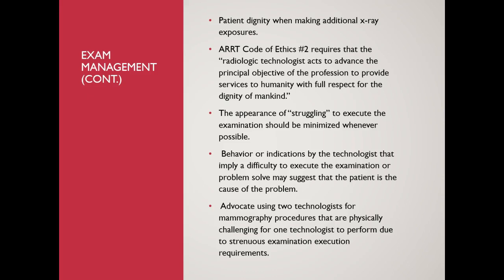The appearance of us struggling or fighting to execute the examination should be minimized whenever possible. Our behavior or indications by the technologist that imply a difficulty to execute the exam or in problem solving may suggest that the patient is the cause of the problem. So we don't want to put the patient on defense.